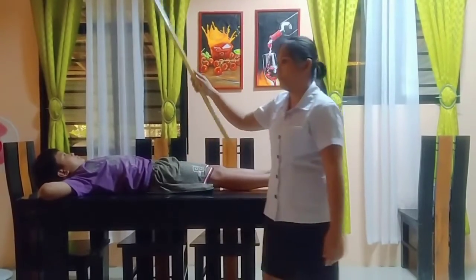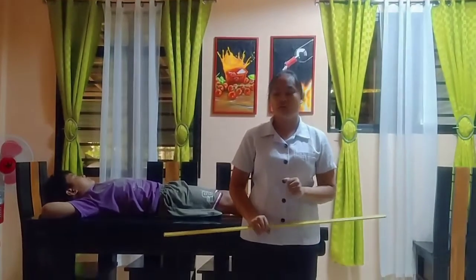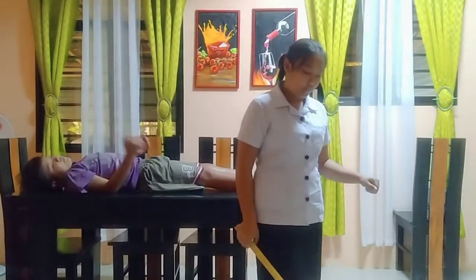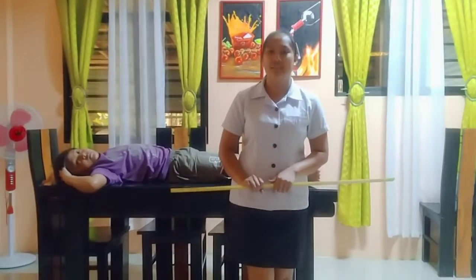So, yan po. This projection shows the entire femur, from neck less distorted, and proximal tibia and fibula if included.